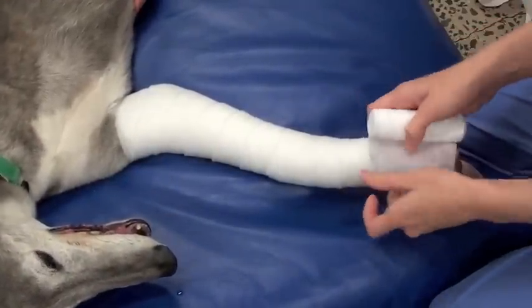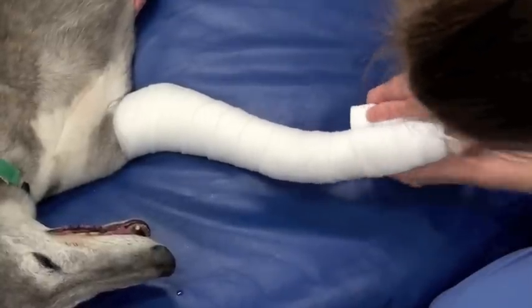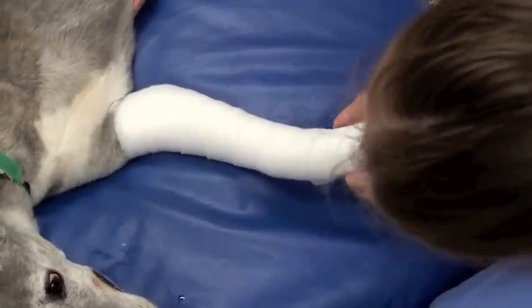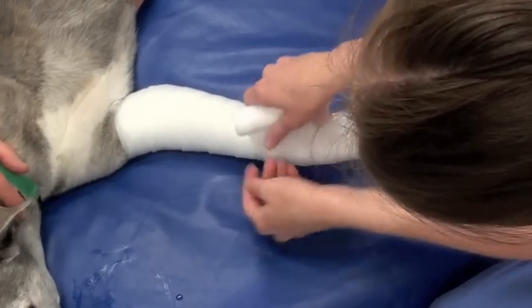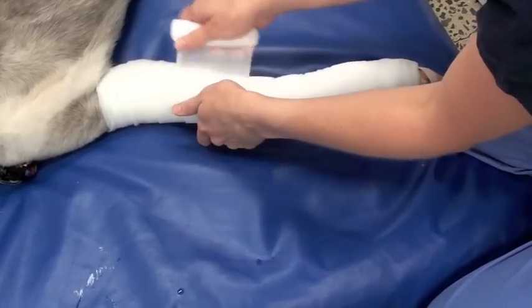The next layer is a cling layer. This is an elastic type bandage and you have to be a bit careful with this, because if it's on too tightly you can create a tourniquet effect. So we just lay that on with a little bit of tension, but not with a lot of tension.